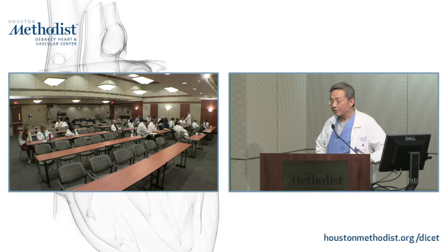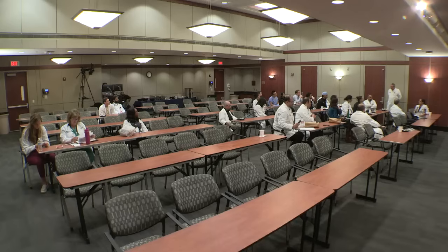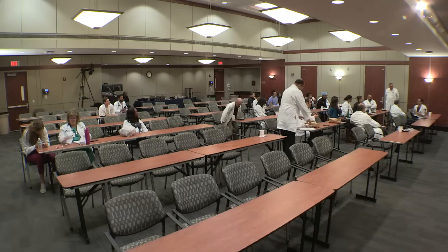But Dr. Q, to your point, the only time I worry about making too many speed changes is that you can have that rapid septal interaction when the RV can just completely balloon out and fail. For safety reasons, it's better to go slowly. Yeah, because otherwise, if you go like 2,000 increments, next thing you know, the RV ballooned out and they're freaking out, the blood pressure is low, and the RV fails. And these are sometimes outpatient studies. So that's the only thing that I would say.